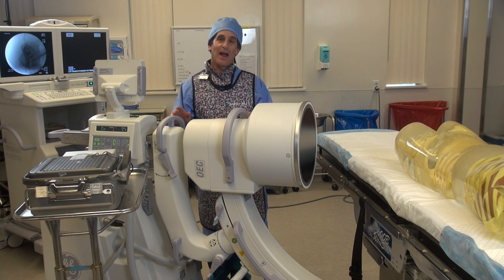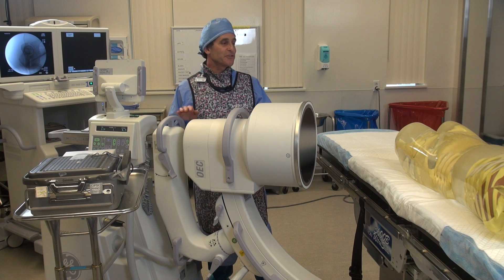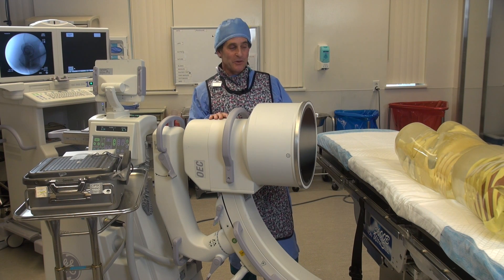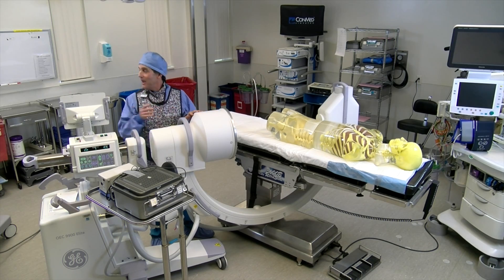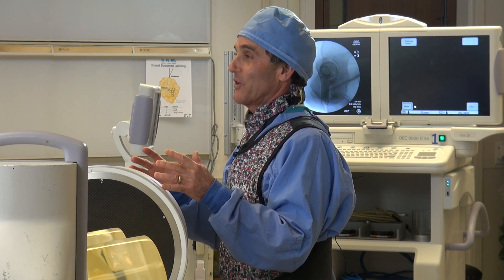We want to show you how much scatter comes out of the patient when you're doing a cross-table lateral hip. We're set up — obviously it's not a real person, so we can't have a leg up in the air like you really would, but we're set up at enough of an angle like you would normally come in on. You can see on the monitor we've already taken a bunch of exposures to get this thing centered the way we want.